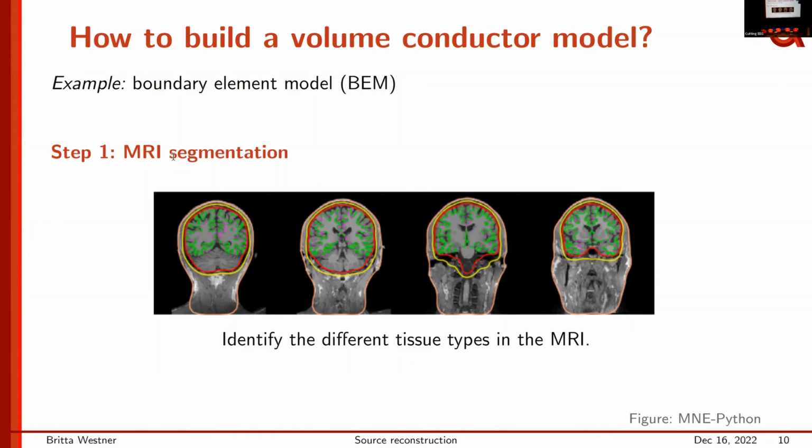You can see here, we have the white matter that follows the cortical folding, but I don't know how good everyone's eyesight is and how this resolves in the back. But for example, here you can see that the algorithm kind of curves onto itself when estimating this.